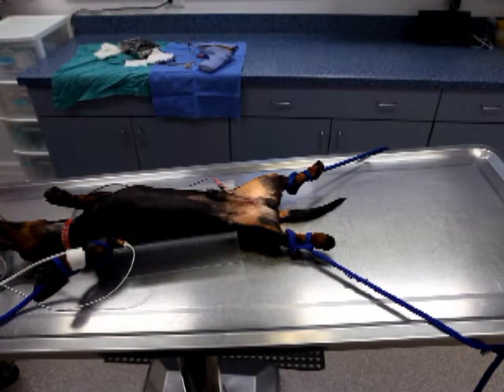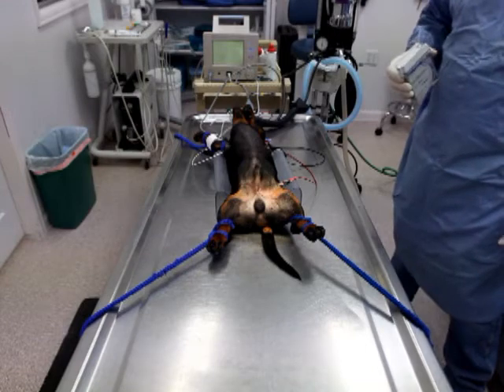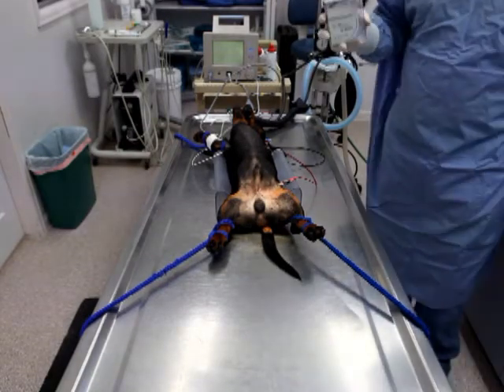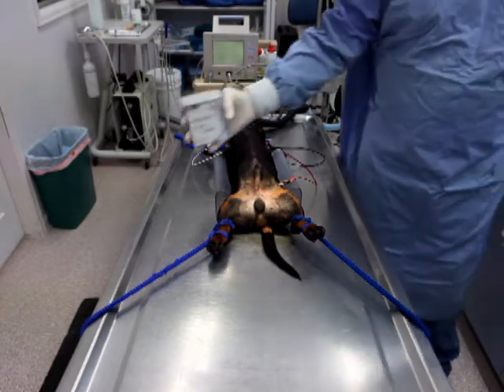Just a shot of the completed procedure. As you'll notice, there's a very clean surgical site with no bleeding. And here's a shot of the PDS on a reel that we've been using. I do appreciate you viewing this video, and if you have any questions, contact SonTech directly or your local sales rep. Thank you.